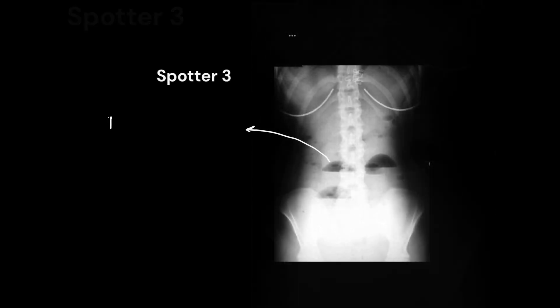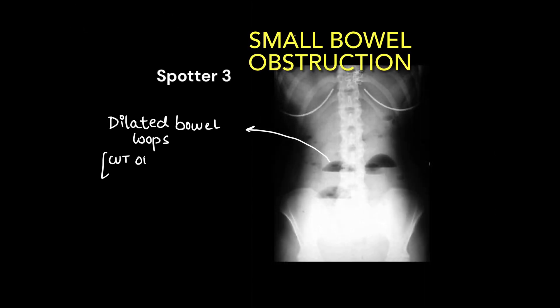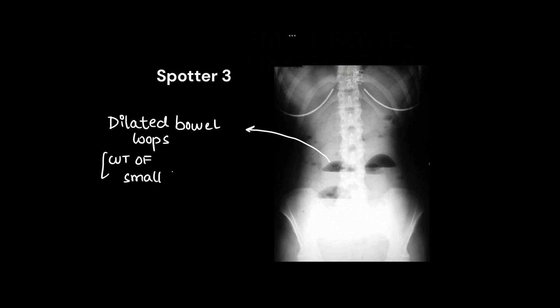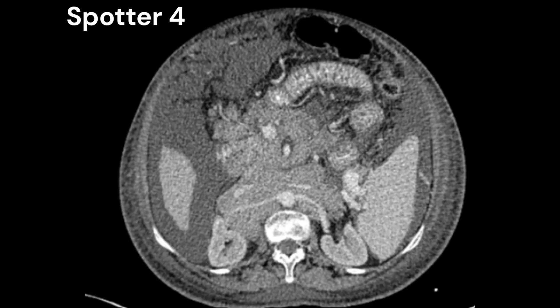This is an easy one — small bowel obstruction on abdominal X-ray. We can see dilated bowel loops. The cutoff is: small bowel 3 cm, large bowel 5 cm, and cecum 9 cm. We can see abnormal air-fluid levels.